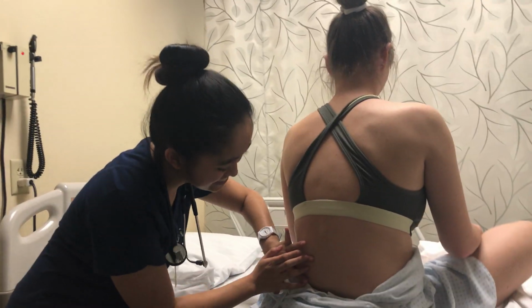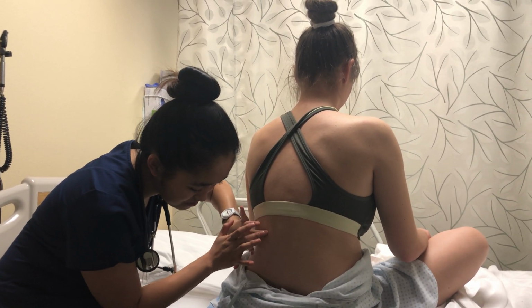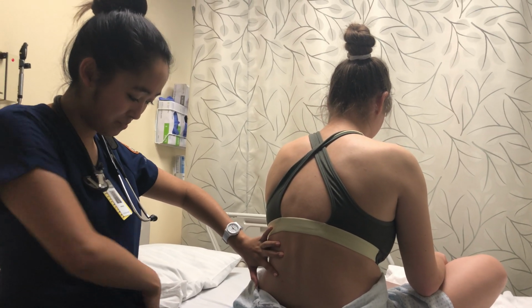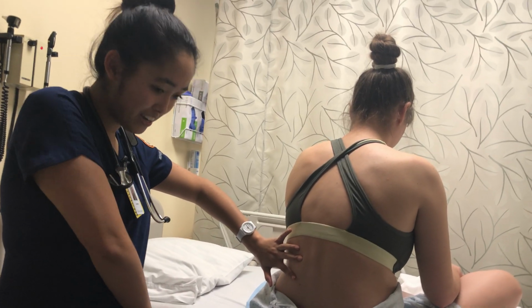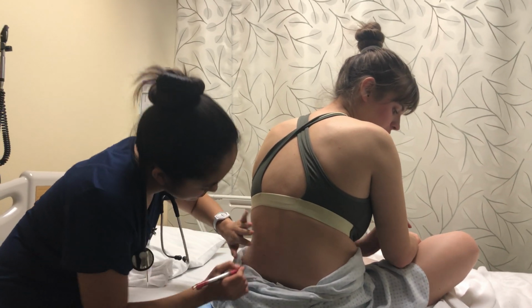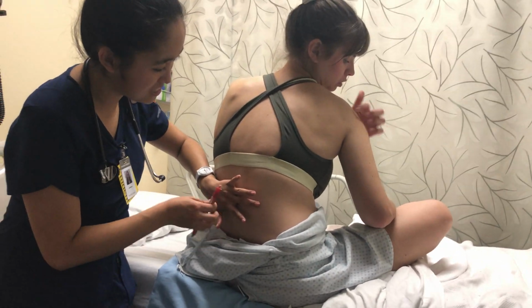Breathe out and hold it. Okay, breathe. Please. Thank you. Oh boy, my pen just fell. Here it is. And right there. Okay, I'm going to do the same thing on the other side. Go ahead and breathe in for me and hold it.